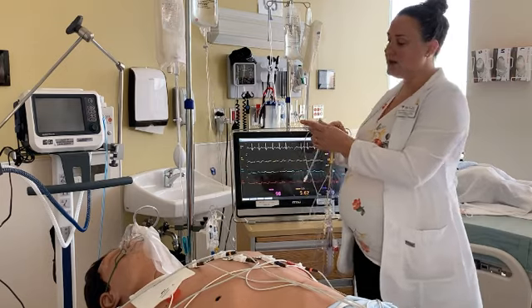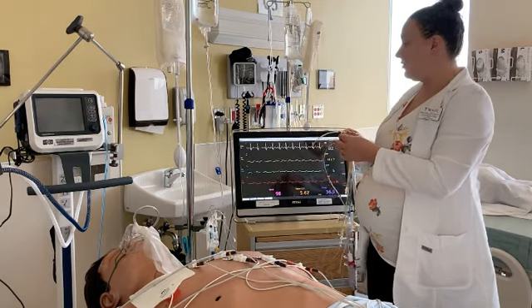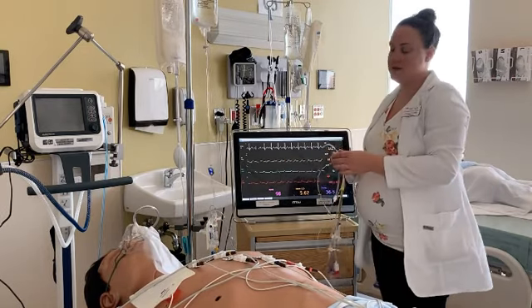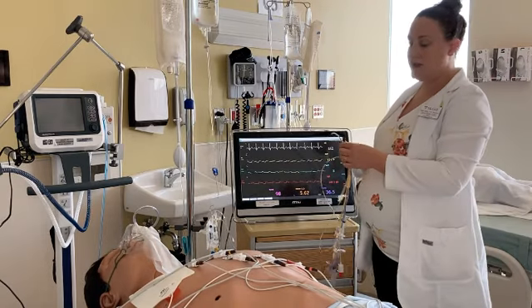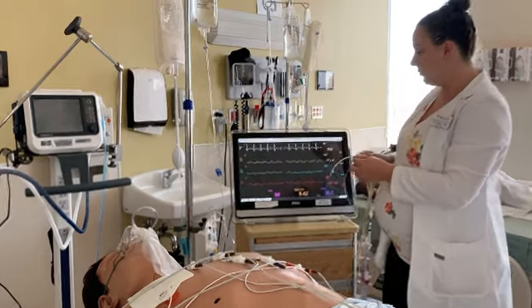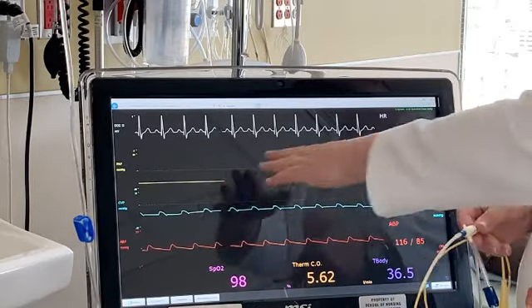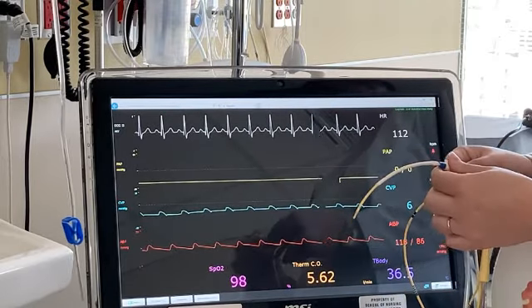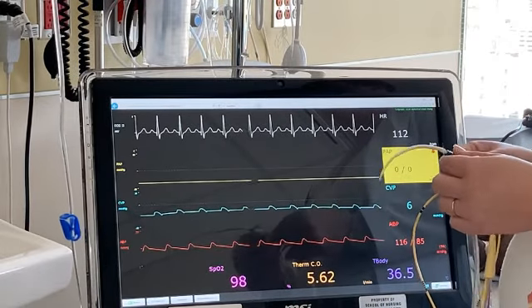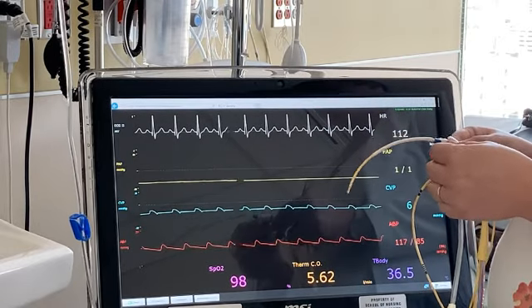So as they start at this distance, they're going to be into the jugular vein. And you would be able to see on your monitor, as you're connected, the changes in the waveform based on its location. So if we start initially, as we insert this catheter, we can look at the waveform and the shape of the waveform. So this is as soon as we connect, what we would see as soon as we can connect to our transducer is just an atmospheric pressure. Then we would move this catheter as we insert it, we would move into the jugular vein.